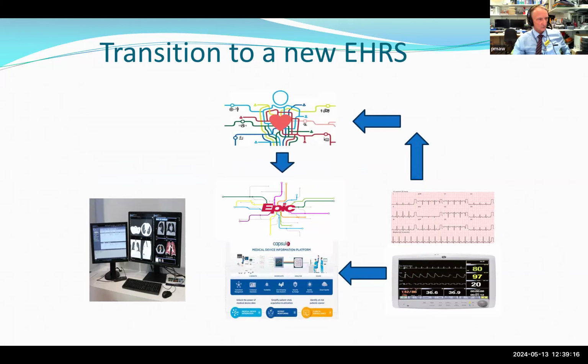The electronic prescribing system went because that was all part of Epic. The PACS system was linked into our Epic system. And Epic became finally the source of truth for patient information. So any patient lookups were done via Epic. So for the patient monitors, for the GE Muse system, and for PACS, all with the same reliable patient demographic information, which was a big change.